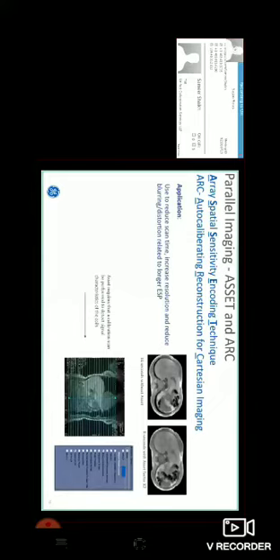Okay, so no phase wrap. This is again one of the common artifacts. Everyone should know how to eliminate these artifacts. Just turn on the no phase wrap option or increase your oversampling option.